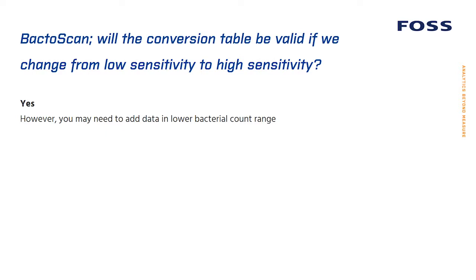BactoScan. Will the conversion table be valid if we change from low sensitivity to high sensitivity? Yes. However, you may need to add data in lower bacterial count range.